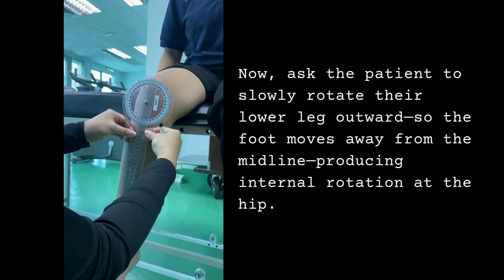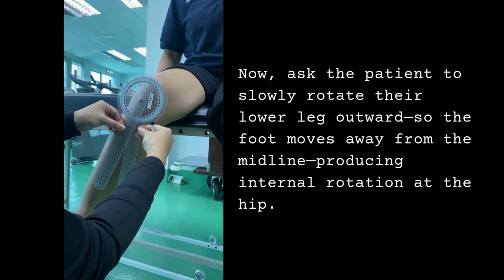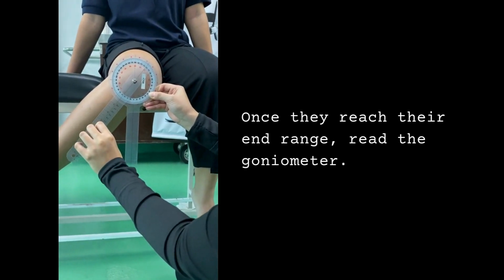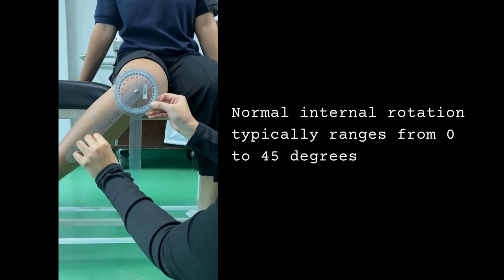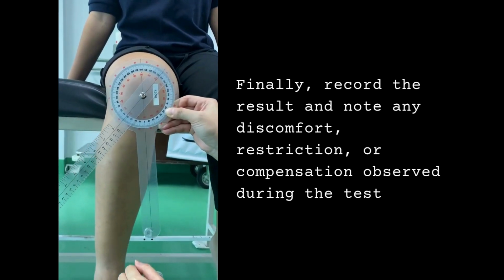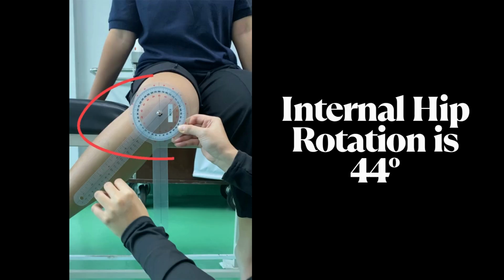Now ask the patient to slowly rotate their lower leg outward so the foot moves away from the midline, producing internal rotation at the hip. Once they reach their end range, read the goniometer. Normal internal rotation typically ranges from 0 to 45 degrees. Finally, record the result and note any discomfort, restriction, or compensation observed during the test.